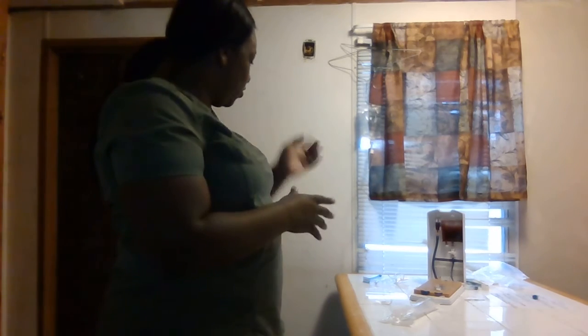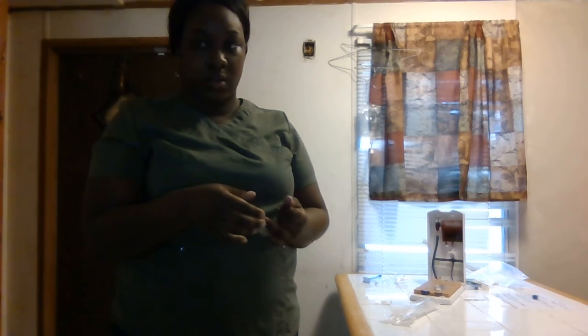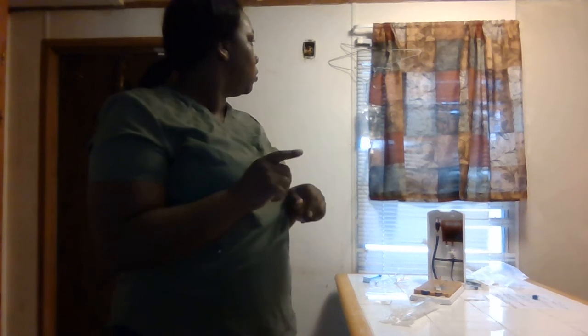When it pops up, you want to just make sure it's the right patient, the right rate, primary fluids, because that's what I'm hanging. Just make sure your pump is set right, and think right channel.